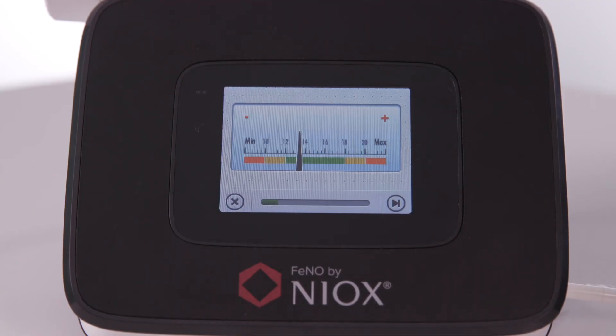Just as a reminder, I'm going to show you what you will actually see on the screen while you're doing that breath out. You've got the gauge here — the needle is moving and you can see it's moving in the green band, and that's exactly where we want it to stay. During the breath out, if you blow too gently or too forcibly, the test will stop and we can just have another go. But the aim is to keep it in the green band.